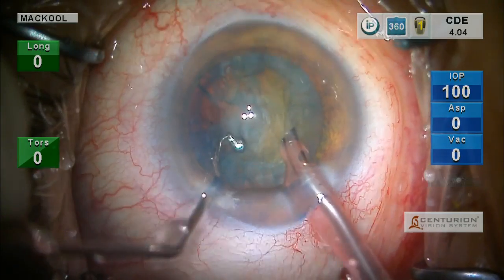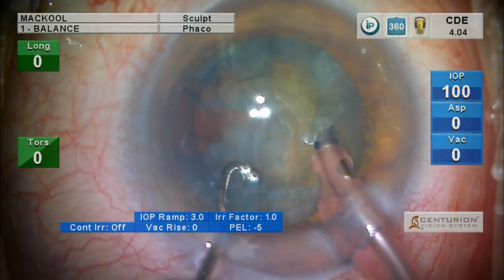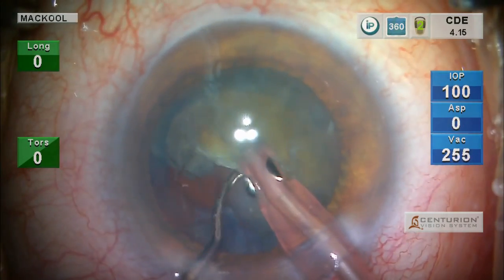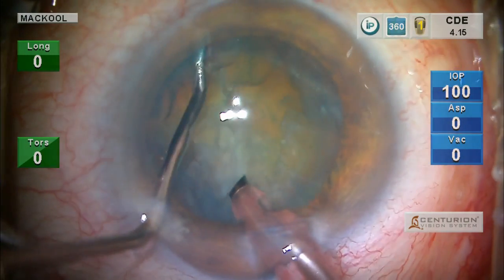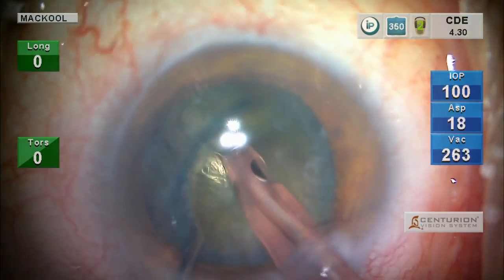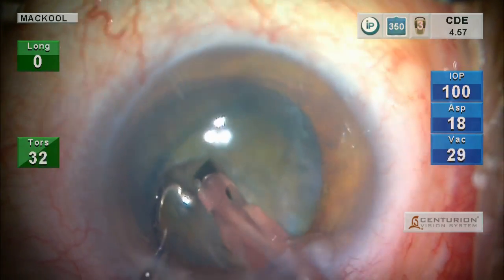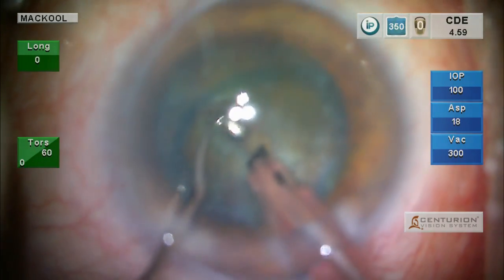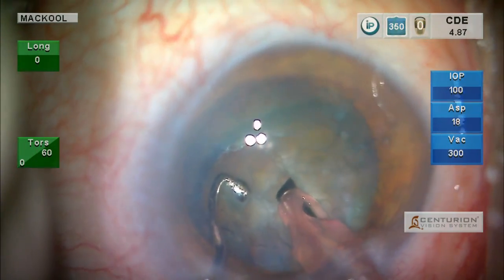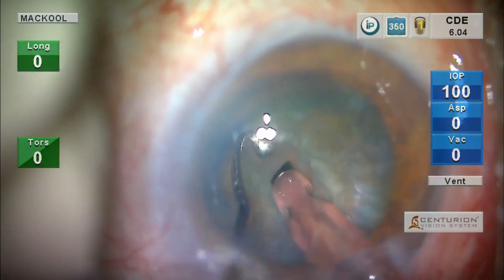Now I want to see how this nucleus rotates because I'm interested in the zonular status. I'm going to rotate it bilaterally and see how it goes back to where it came from. Now I impaled it and rotated it — that's a little carousel kind of maneuver. We're still on sculpt, so I'm going to impale this nucleus and chop it. These are maneuvers designed to keep the zonule happy.